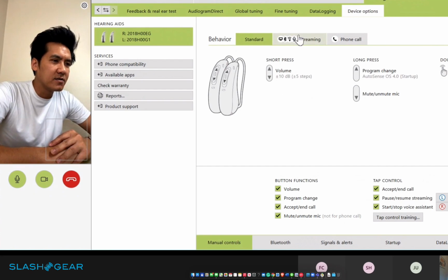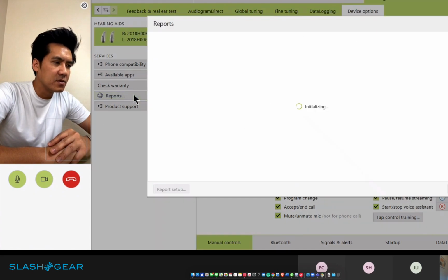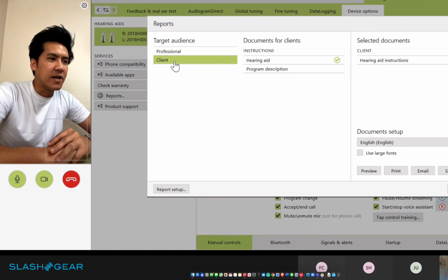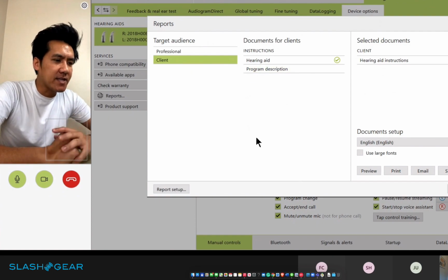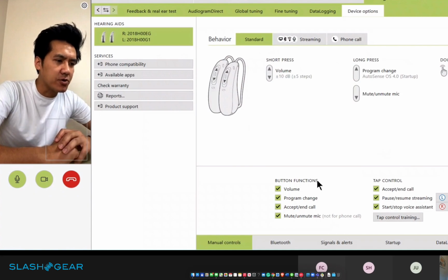And I can see there's a lot of functionalities here, and I don't expect you to remember. So what we do for clients is I have this report, and I'm happy to email it to you. Oh, that would be great. But before you do that, can I look at one more thing? The signals and alerts. Can I look at that tab?